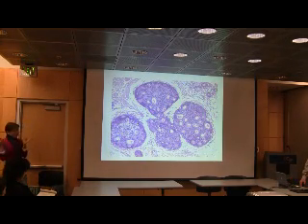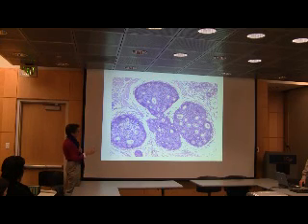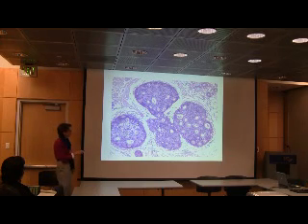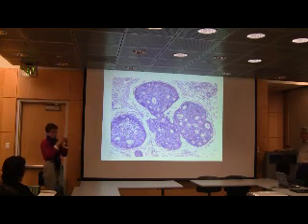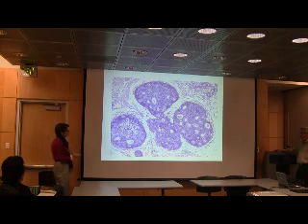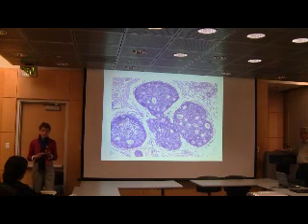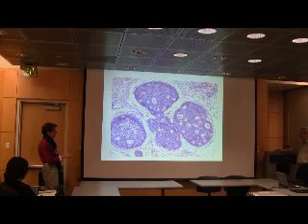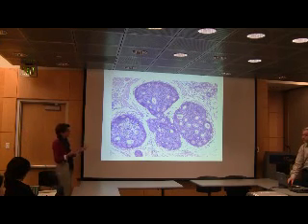All right, so we saw a high end of carcinoma in situ. Now this is the low end. So here the pattern is very different. We still have very dilated structures, but the cells are much smaller. The nuclei are small and round, and they look very similar to what benign cells should look like. But there are too many. It's too piled up, and the structures are dilated to a great extent. And then you have these round empty spaces fairly evenly distributed through this. So this is a low-grade carcinoma in situ with a cribriform pattern. The cribriform is this kind of pattern with empty spaces that are distributed throughout. So that's the other end of the spectrum of carcinoma in situ, but still contained within the basement membrane.